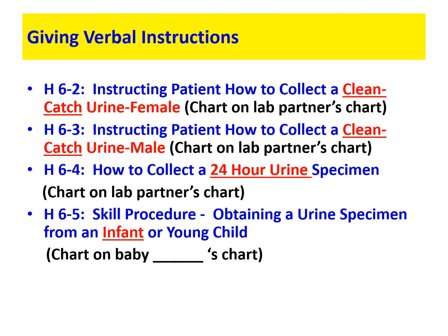Also make sure whether it's a female patient or a male patient or the parent of a child that they wash their hands prior to performing this and then wash their hands after they're done. So if you're giving instructions to a male, it would be the same thing. He needs to go into the restroom with his supplies that you have given him. He needs to make sure he washes his hands before the procedure.